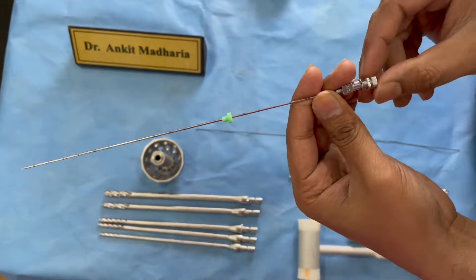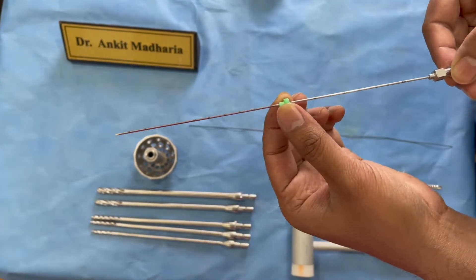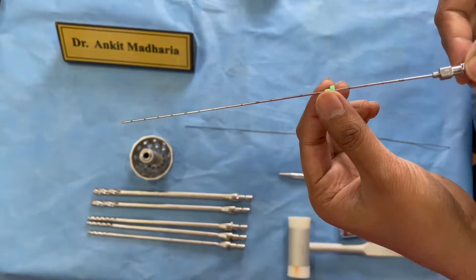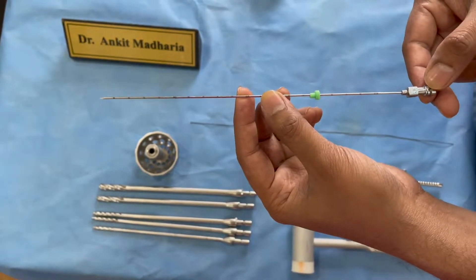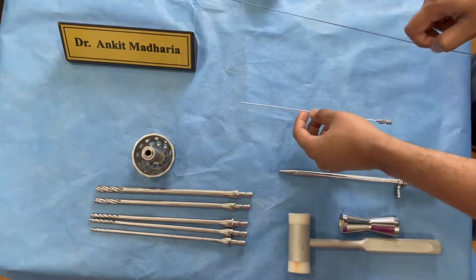There is a slit and '18' is written over here, and this is the stopper that you can use to demarcate the depth where you need to reach. This is the first instrument you need to have: an 18 gauge, 20 or 21 cm long needle which is autoclavable and reusable.